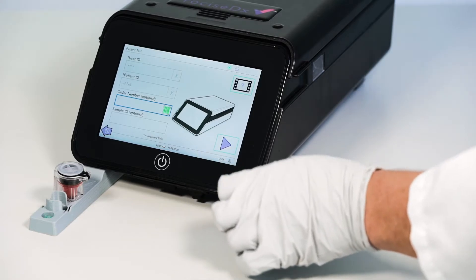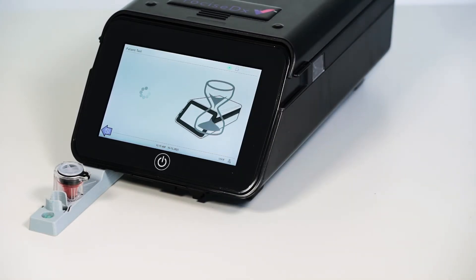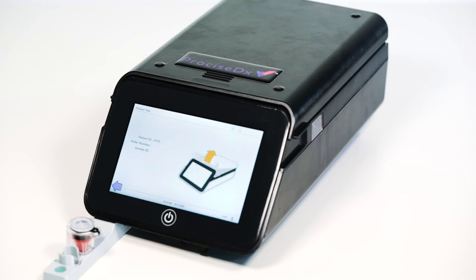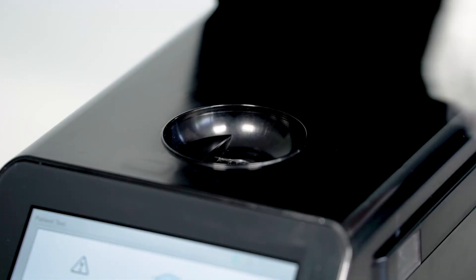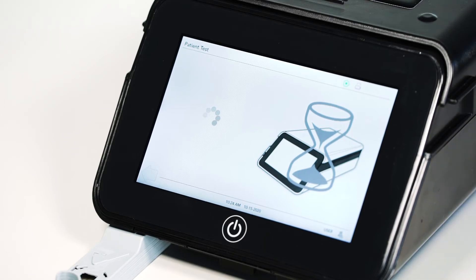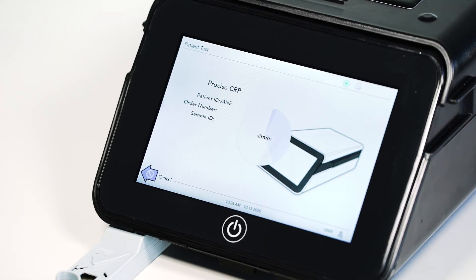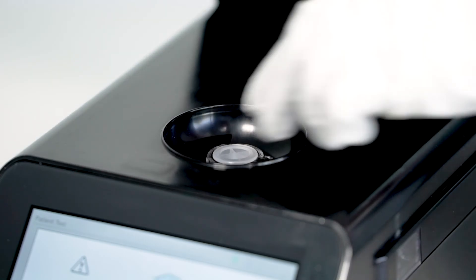After the required fields are completed, the start button will become available. Select it and wait while the system runs a self-check. When instructed, open the lid and insert the cartridge. The cartridge will only fit in one way. The system will read the barcode on the cartridge and begin the correct test method. A countdown will appear on the screen. When the test is complete, the system will give an audible sound and instruct you to remove the cartridge.